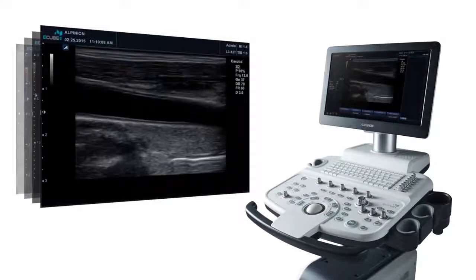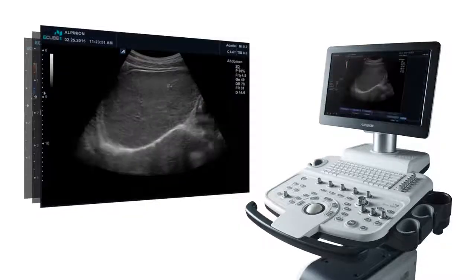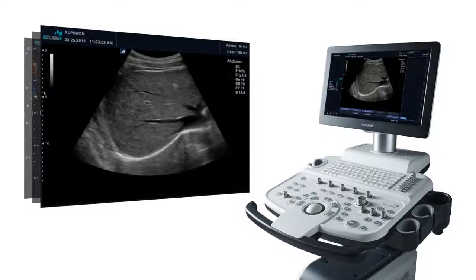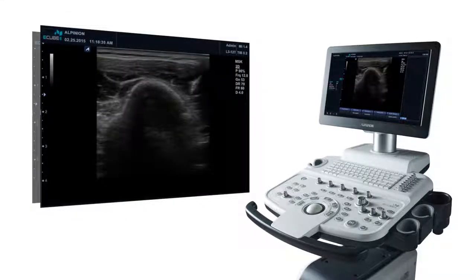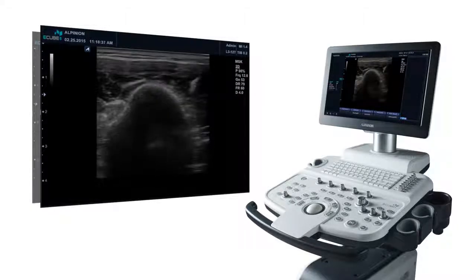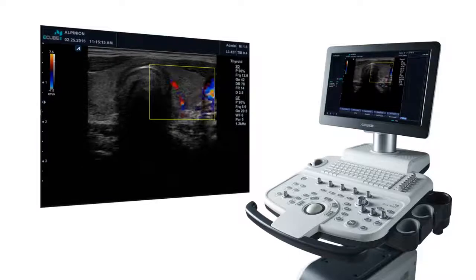The E-Cube 5 offers premium features such as SRI speckle reduction, auto IMT, spatial compounding, and structured reporting. Most importantly, the 2D image quality is very good for the price — about what you'd expect out of a unit from a top brand costing several thousand dollars more.